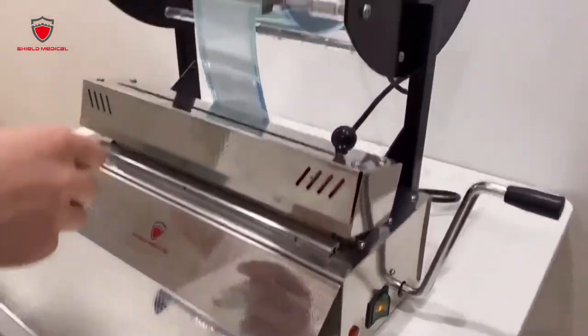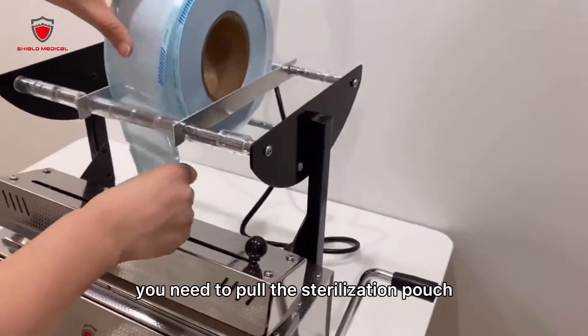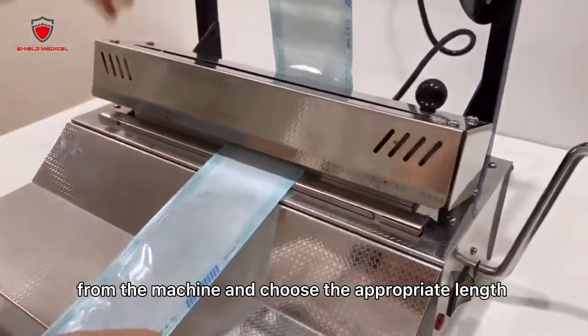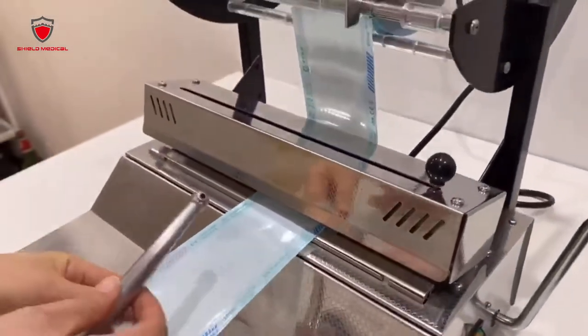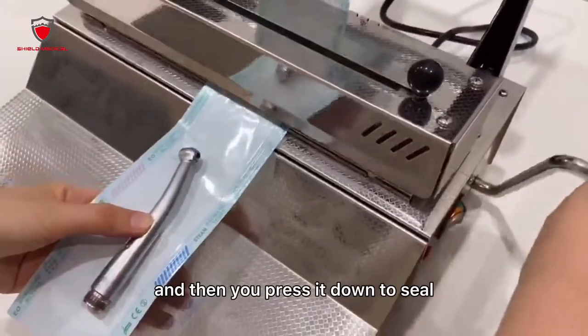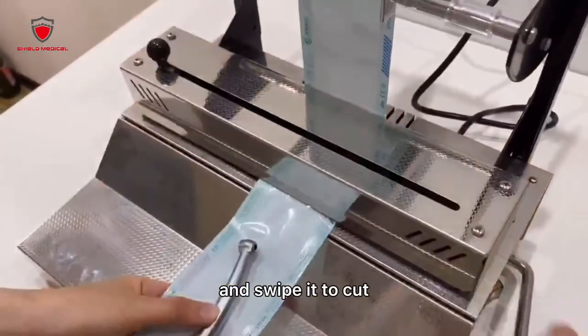Now the light is off. Pull the sterilization pouch from the machine and choose the appropriate length for your instrument, like this. Then press it down to seal and swipe it to cut.